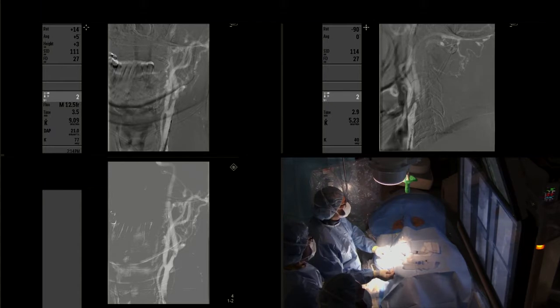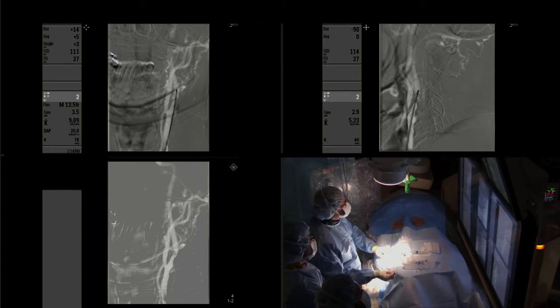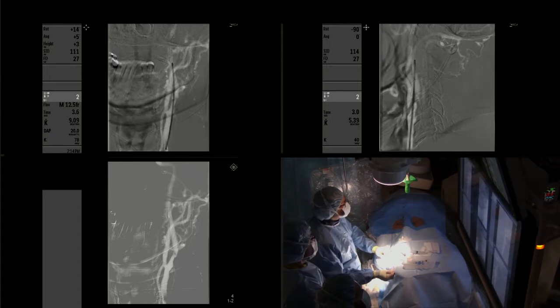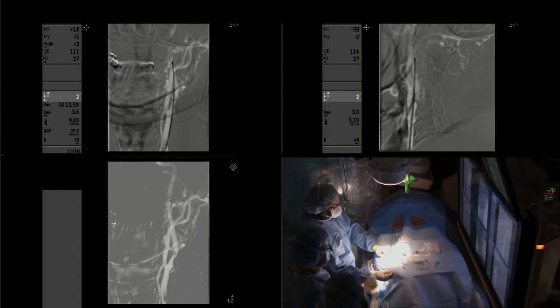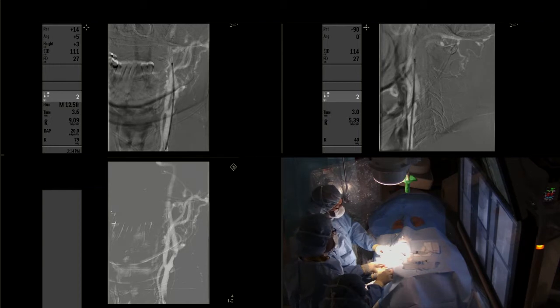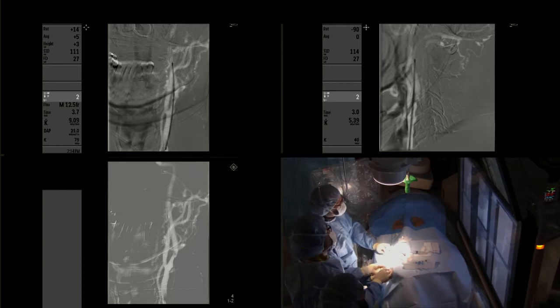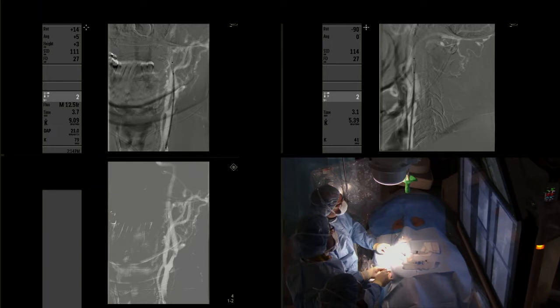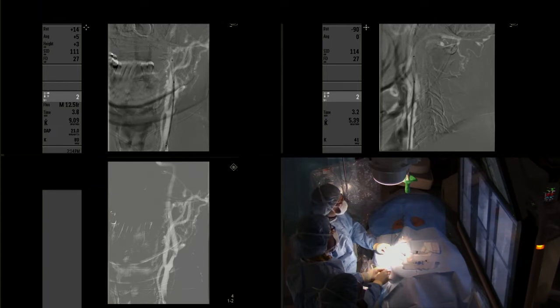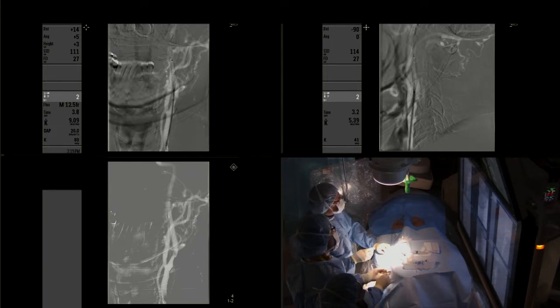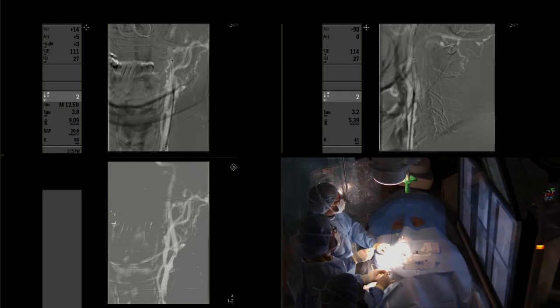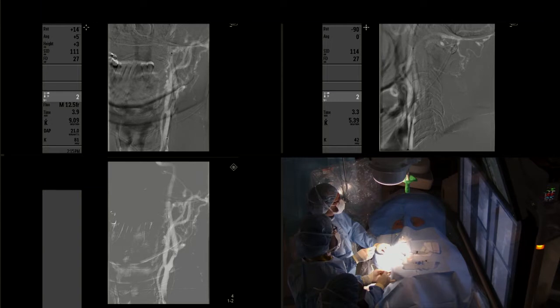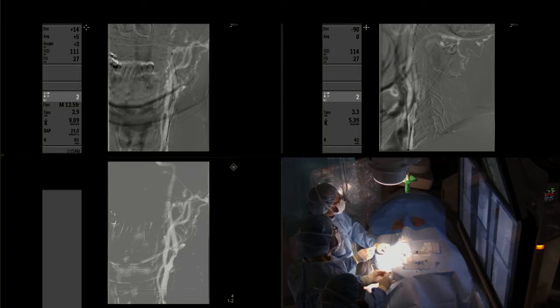Now we are advancing the stent and we center it across the area of severe stenosis. In this specific case we use a carotid wall stent 8 mm by 36 mm that goes from the mid cervical segment of the left internal carotid artery being deployed on the way down to the distal common carotid artery on the left side.